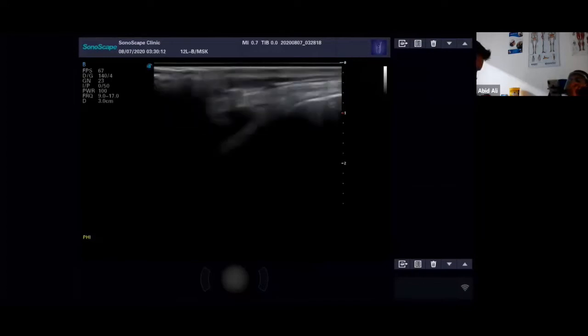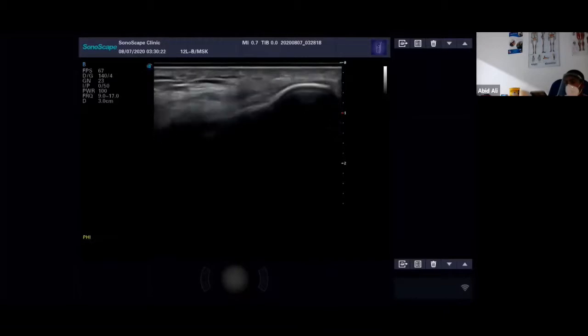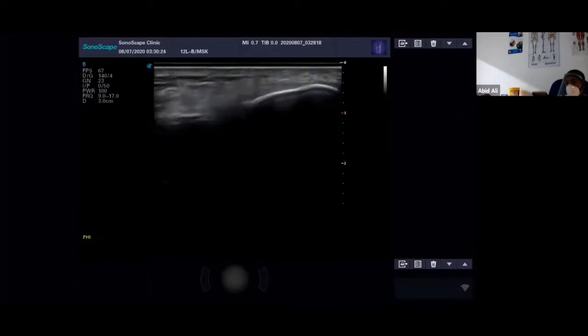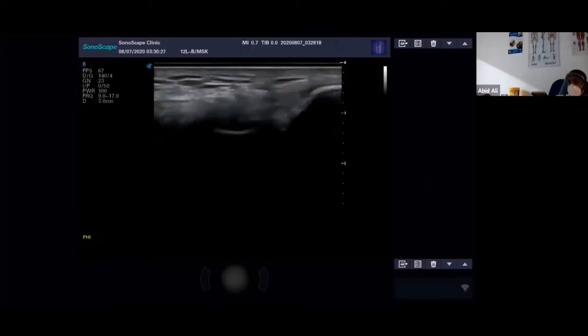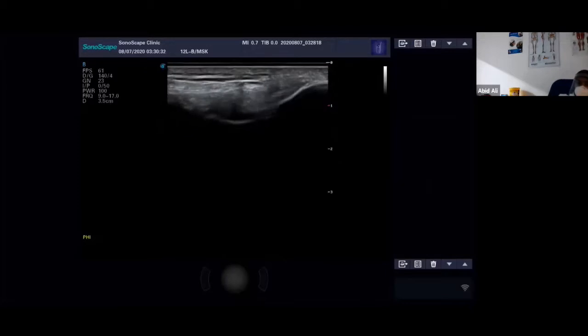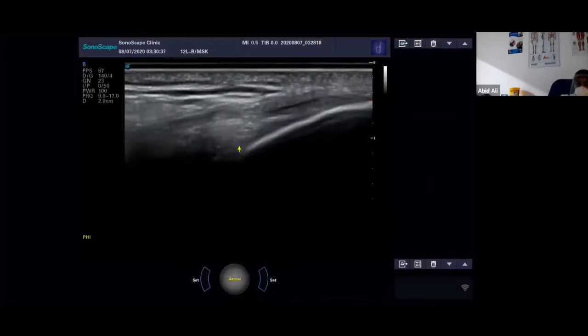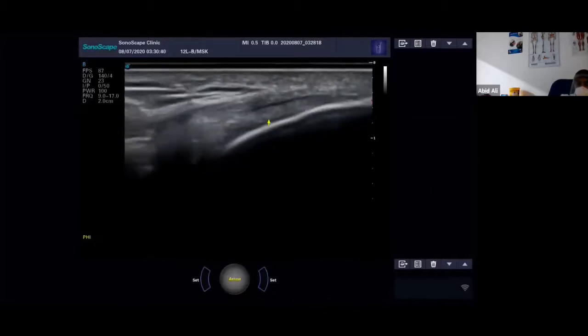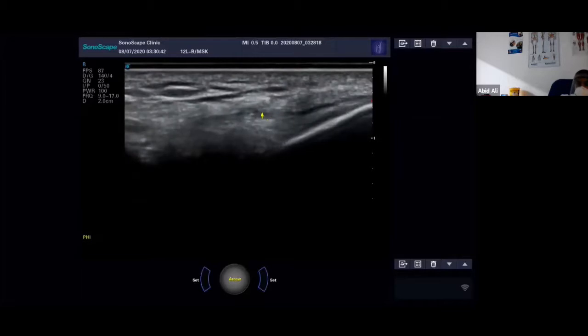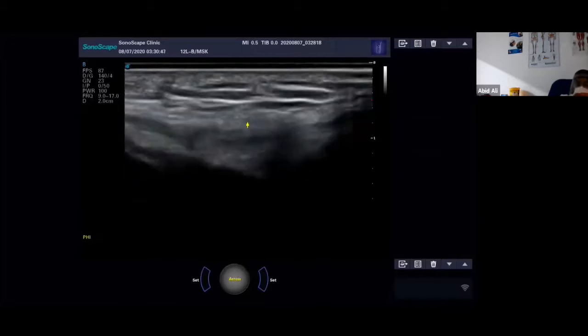So when you want to find the lateral collateral ligament, it's best to just, instead of trying to find it, palpate the fibula, put your probe right on the fibula, then you know you're in roughly the right place. And it's going to be, I don't know whether you can see that little, hang on a minute, little black structure. This here, and because of the way it is, the contour is quite undulating.